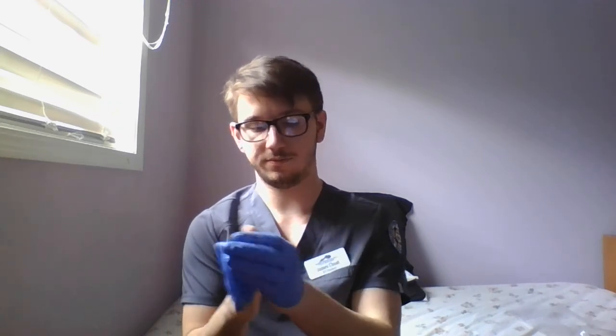I'm gonna take off my gloves, dispose of everything properly. Set this to the side here. The gloves, and then I'd perform hand hygiene. And I would document that I gave an injection.